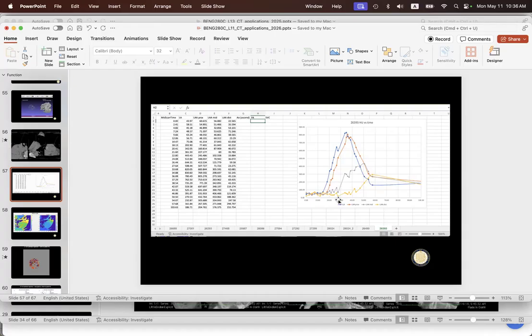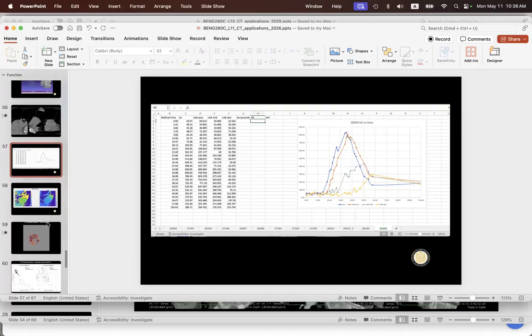So you can see there's a long delay in trying to fill the distal part of that left atrial appendage with contrast. And midway up, there is a delay, it's not as much. But this patient, you would say, has flow that has been compromised by their atrial fibrillation. And it's a pretty cool application.